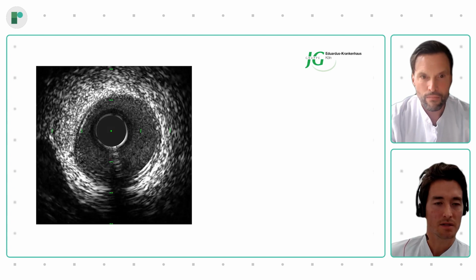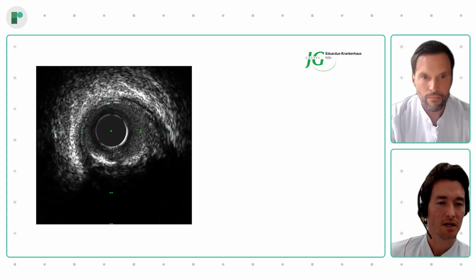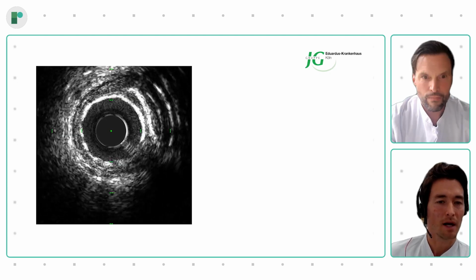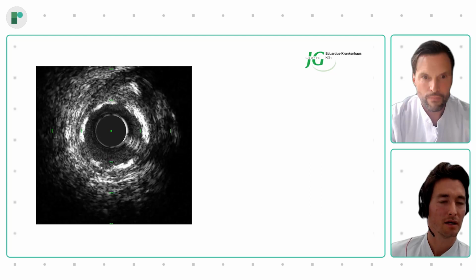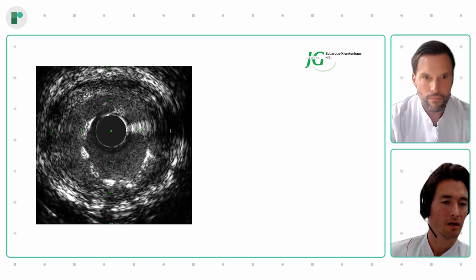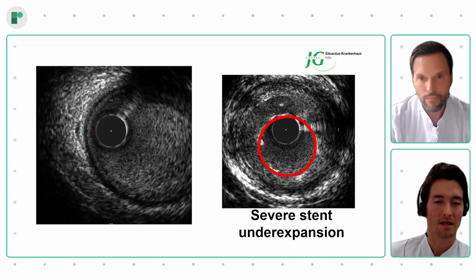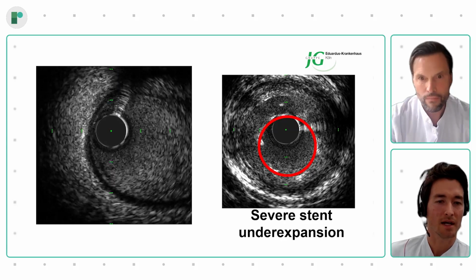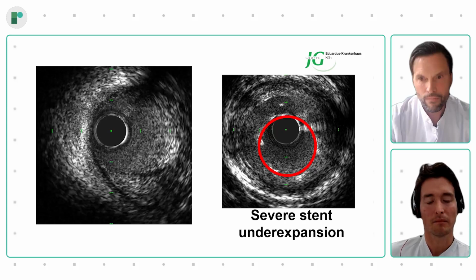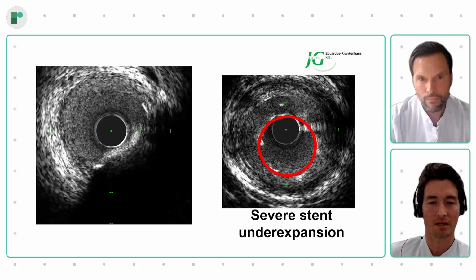And very surprisingly, you see a finding. Just briefly, you can see in this left-hand image a fairly healthy vessel, some mild calcification, and distally a fairly well-apposed stent, then the side branch at 8 o'clock, and a severe under-expansion of the stent, which you can appreciate on the right-hand side. The angiography really did not make you suspect this severe stent under-expansion or malapposition.